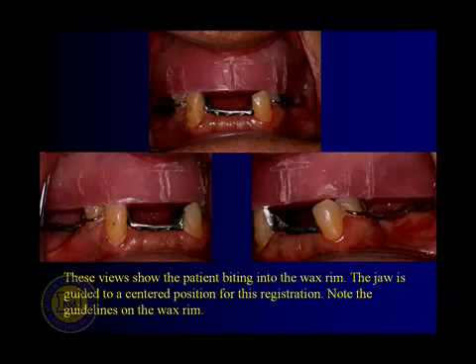So when a person's breathing through their nose with their lips together and their face is completely relaxed, their teeth should be almost but not quite touching. You all clear on that? Almost but not quite touching. Now what I usually do just to see what that distance is, I don't bother trying to send my patients home looking like they've got a giant blackhead on their upper lip and their chin.